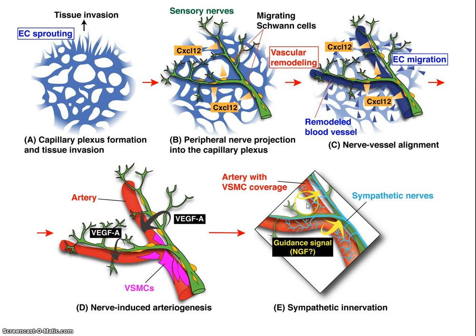So this is a slide for a totally different purpose, but in the last few seconds of this first recording, I just want to point out the sympathetic peripheral nervous system. But if we're thinking in the CNS, this would be an unmyelinated axon, a myelinated axon, and a blood vessel. So here we're seeing the periphery, the Schwann cells migrating, but there's always migrating cells, peripheral, central. What are they on? What resolution do we have to be able to determine that? So we'll stop here with the first recording, and we'll pick up with the second one to build on these ideas.